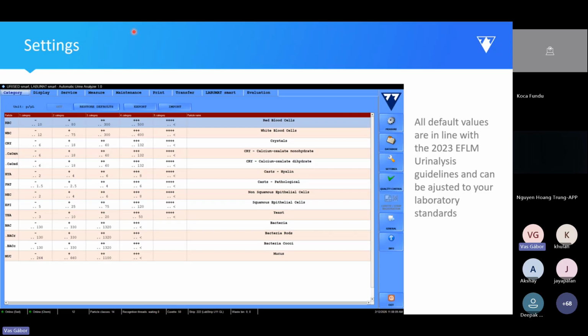And also it often depends on the health authorities how many categories, for instance, you need to put your results in. So this is why it's a very highly customizable part. Yeah, so please make sure you meet your laboratory standard or your customer request on the cutoff values. So you can adjust not just the limits, but the number of categories and so on.